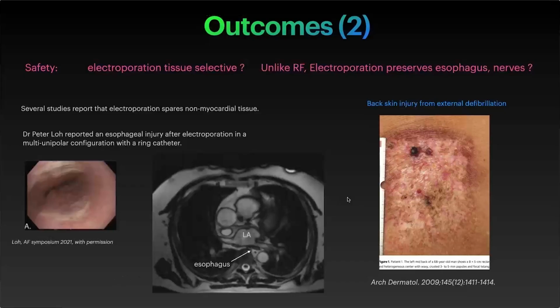People have often noted that with external defibrillation, which also uses very high voltages, there are skin burns. It's always been called a burn. But I have worked with external defibrillation on benches, and you can apply a defibrillator to a series of resistors and touch them right after the pulse, 360 joules. They get warm, but not so bad as to cause this type of injury. So you have to wonder, is this an injury from a burn really, or from electroporation?